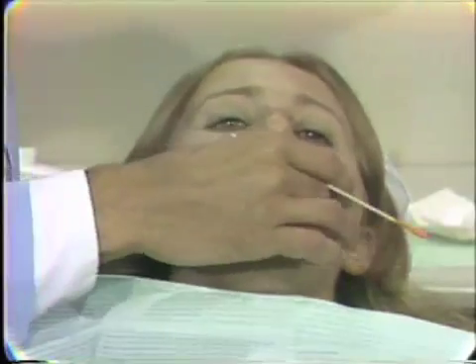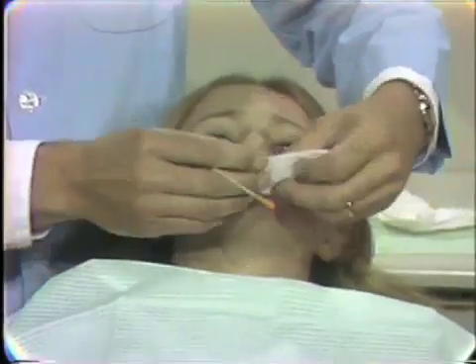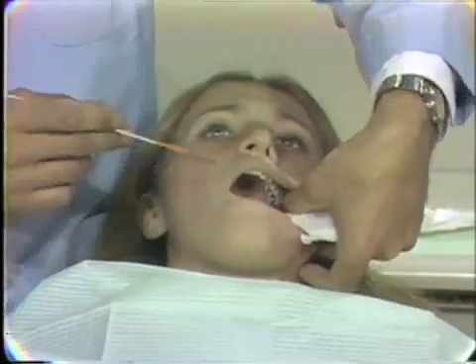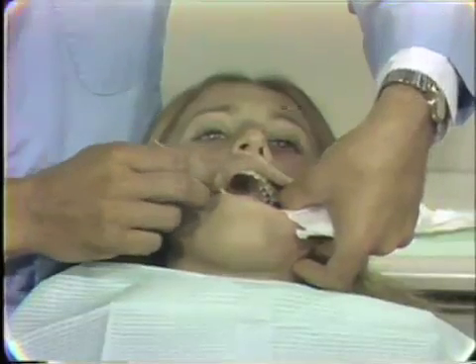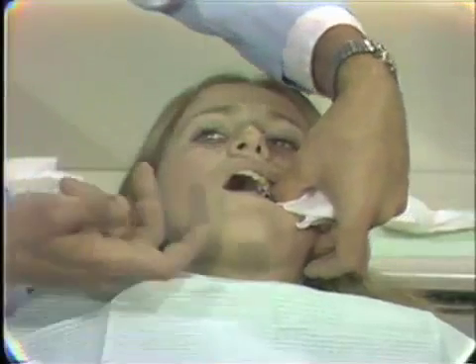When you get ready and have your syringe ready, remove that piece of gauze. If you have your second piece of gauze laid over your thumb and held with your fingers, you can go back and wipe the site, leaving the gauze between your thumb and fingers, then swab with the mercrescent. Again, reaching behind the patient for the syringe, drop the tip off, and you can come in from underneath.